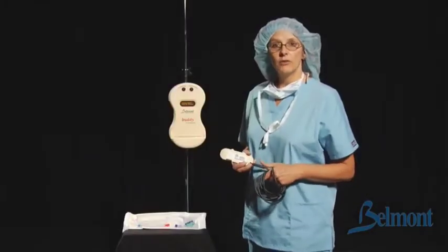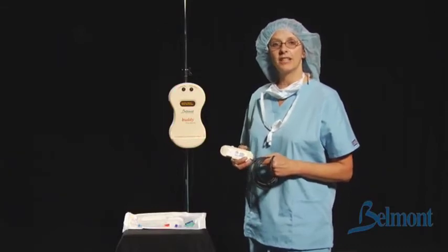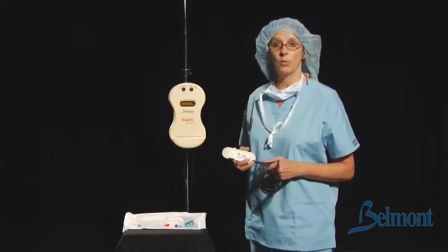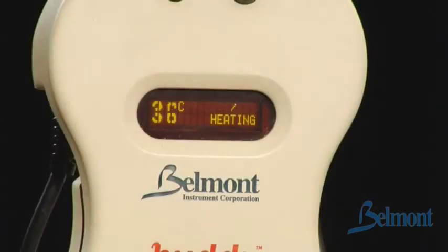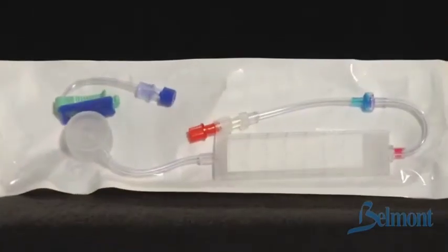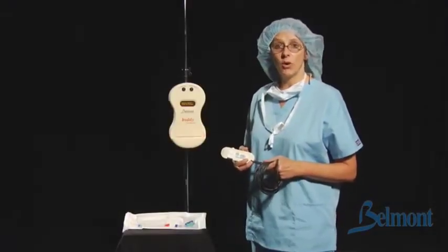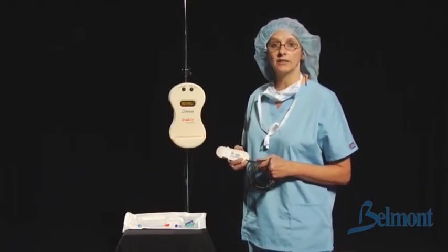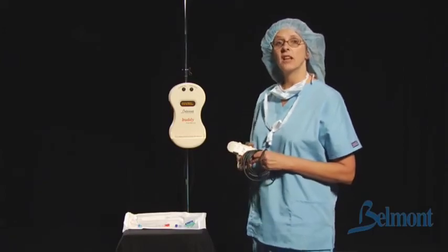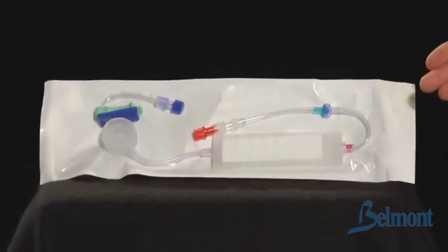Hello, I'm Lisa Fornicoya with Belmont Instrument Corporation. I'm going to show you how easy it is to set up the Buddy Fluid Warmer. The Buddy is a safe and effective near-patient dry heat fluid warmer with an ingenious disposable set. It's capable of warming fluids to normothermia at flow rates up to 6 liters per hour or 100 mLs per minute. The Buddy consists of three main components: the power module, the miniature heater unit, and the disposable set.